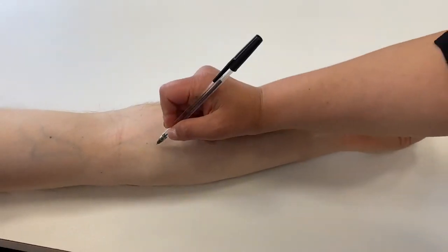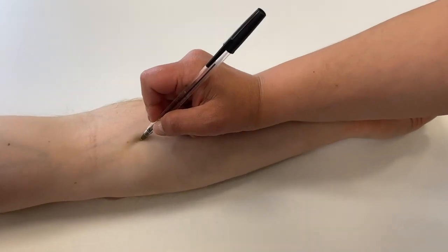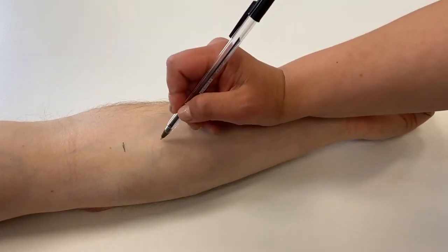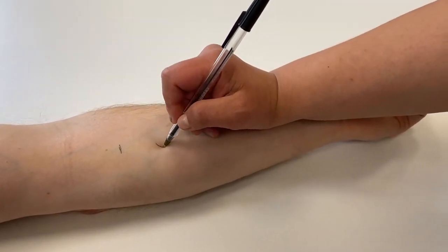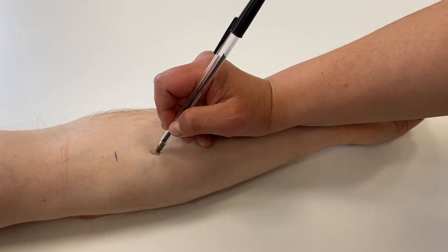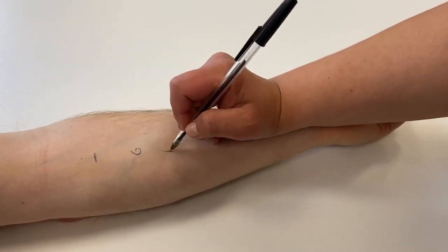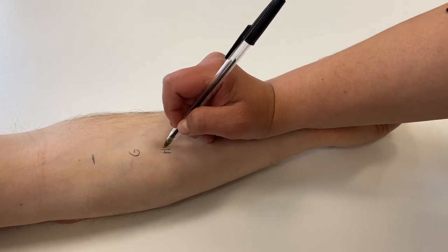Once we and the patient are happy to proceed, we mark the skin. Alex is using a biro to label where she will apply each allergen, to avoid any confusion regarding interpretation of the results later on. Generally, we start with a negative control proximally and place the positive control at the most distal position.